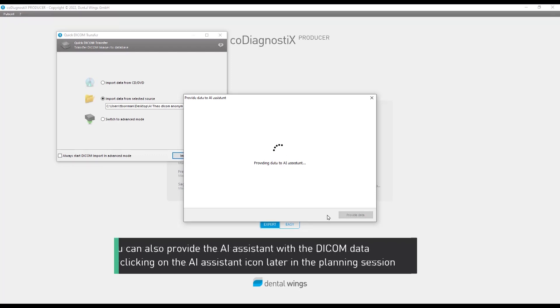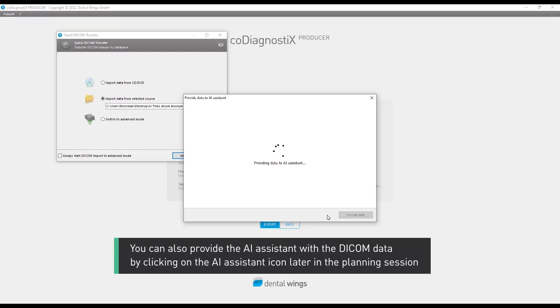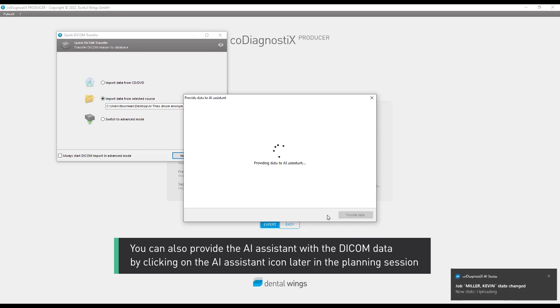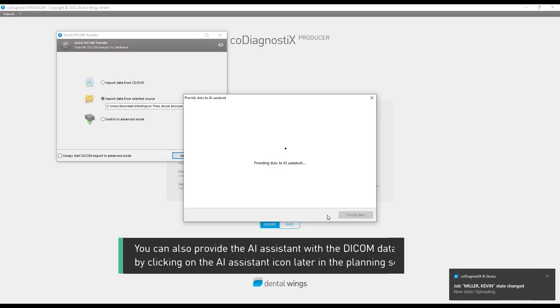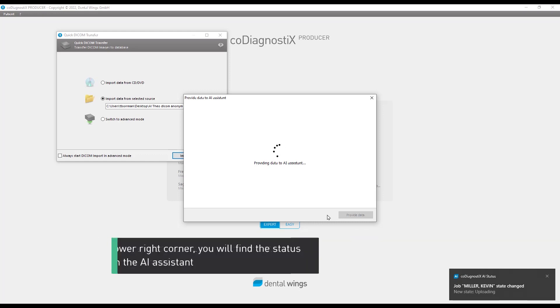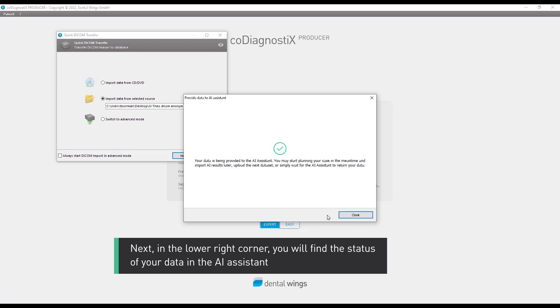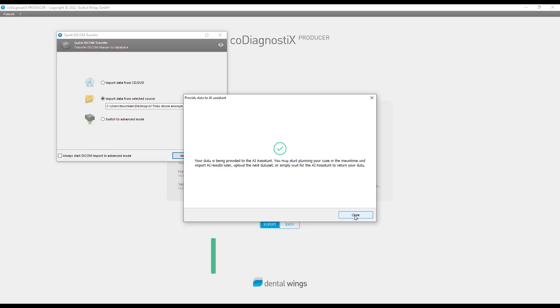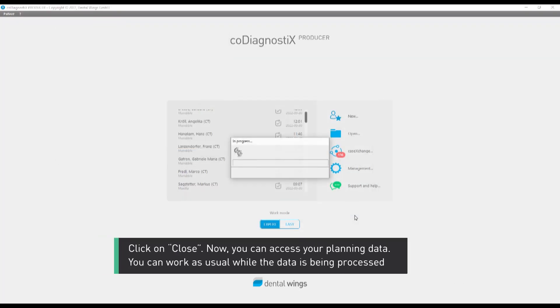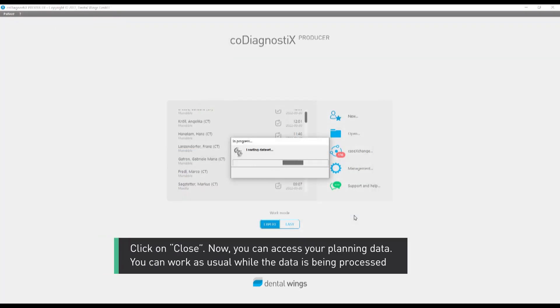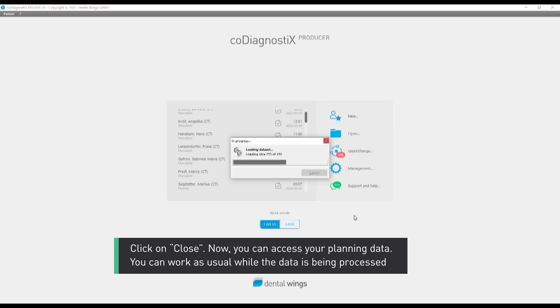You can also provide the AI assistant with the DICOM data by clicking on the AI assistant icon later in the planning session. Next, in the lower right corner, you will find the status of your data in the AI assistant. Click on Close. Now you can access your planning data. You can work as usual while the data is being processed.